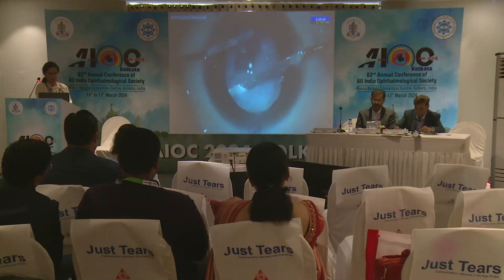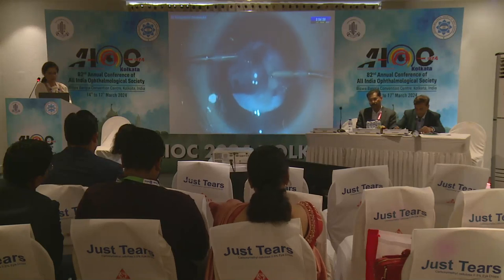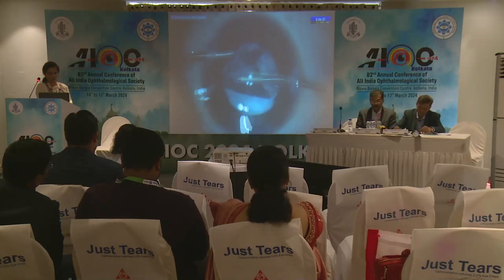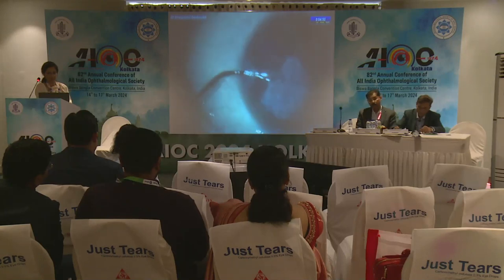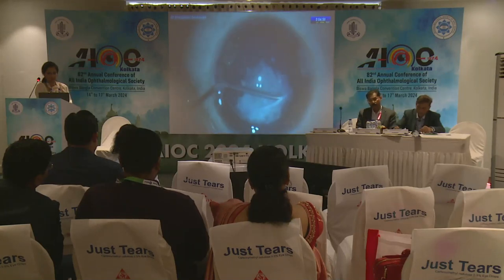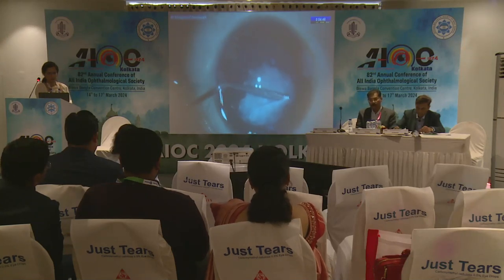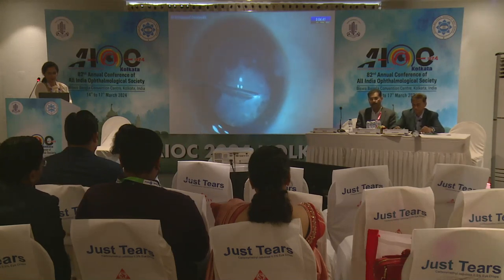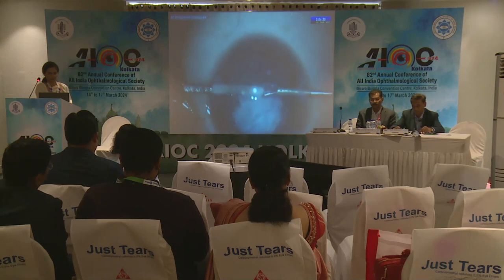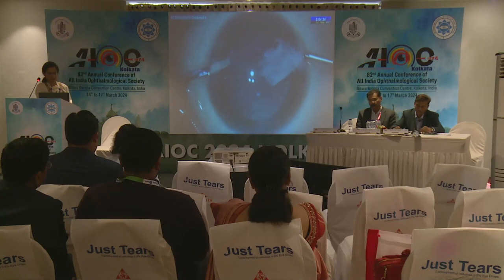Meanwhile, I aspirate the remaining semi-liquefied lens material with bimanual irrigation and aspiration. Now, the last task is taking the fibrous membrane out of the eye. I try to dissect the superior adhesions by injecting the cohesive viscoelastic between the anterior capsule and the membrane, and finally the membrane is free and I pull it out with the microcapsular forceps in toto.